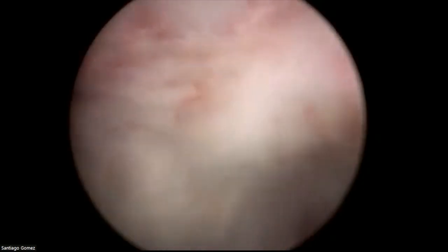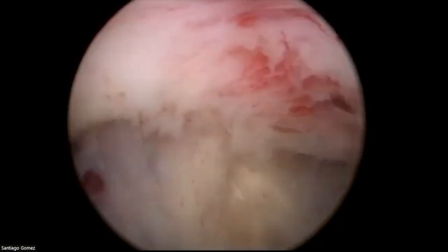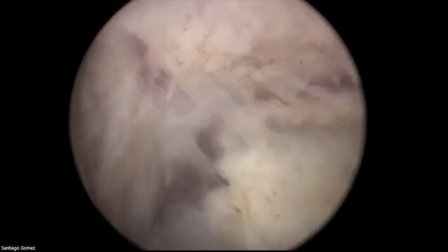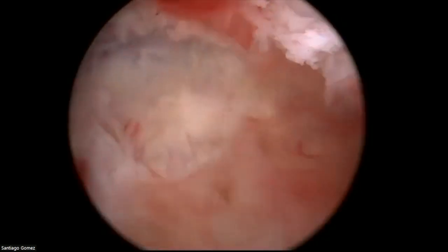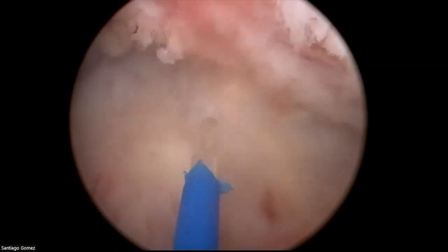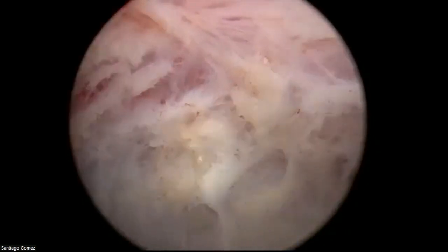Here, what I'm trying to do now, and as I will explain later, I try to position my scope so that half of the screen is with adenoma and half of the screen is with capsule. And you see the line is in the middle. And now I'm keeping my scope. You see, I don't work with the fiber like that, very far away, because when I put my scope closer to the plane, there is some traction and counter traction on the plane.